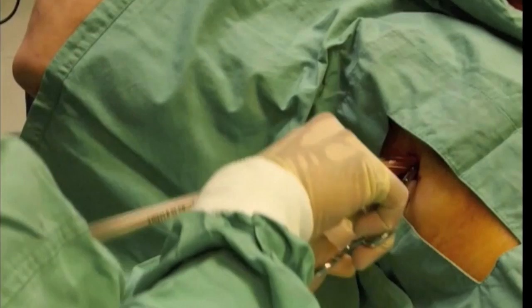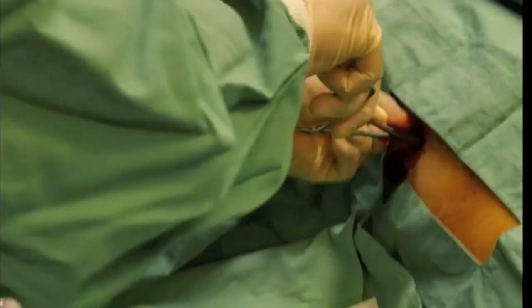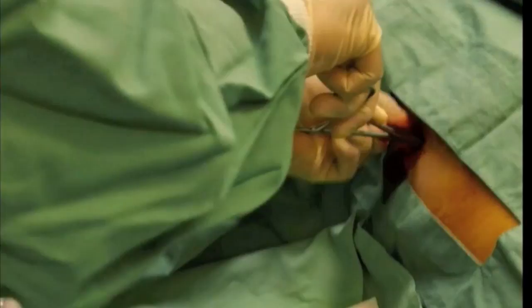Blood will come out. Clamp or be ready to clamp the tube. Secure with interrupted silk sutures — the last one around the tube. Don't use the Roman sandal style.